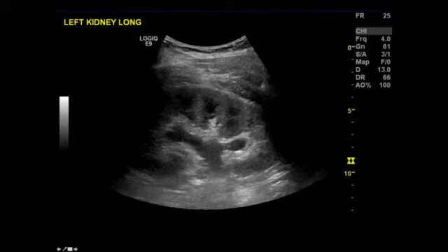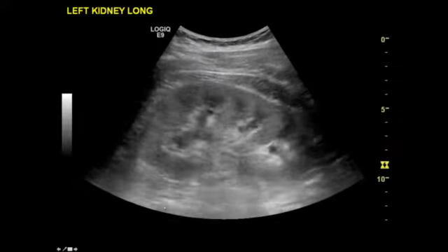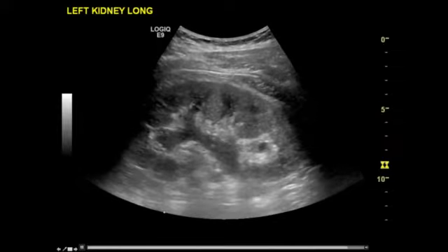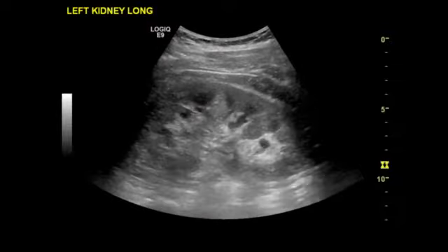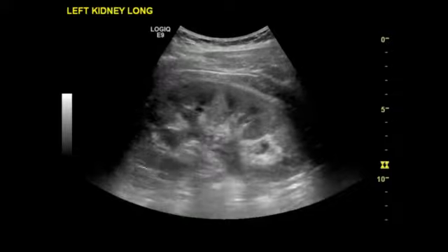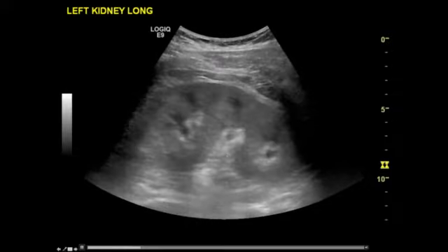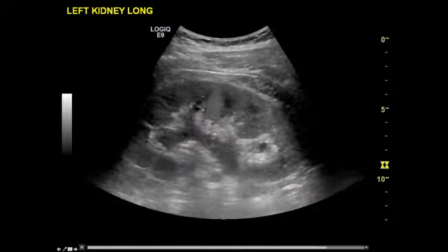And here's another example. When we play that, you see that distended collecting system, hypoechoic, the renal cortex certainly maintaining its thickness there. And I dare say that's mild, with some maintenance of those nice little cupped calyces that you're seeing here. So mild hydronephrosis.